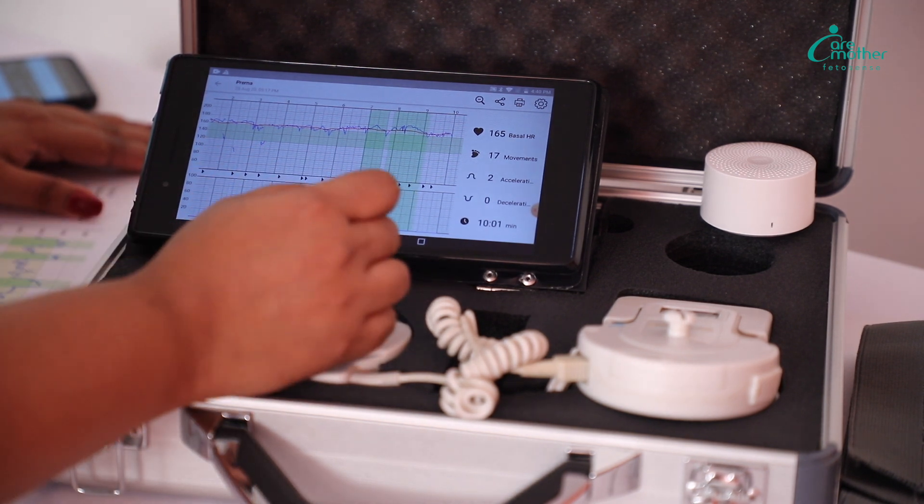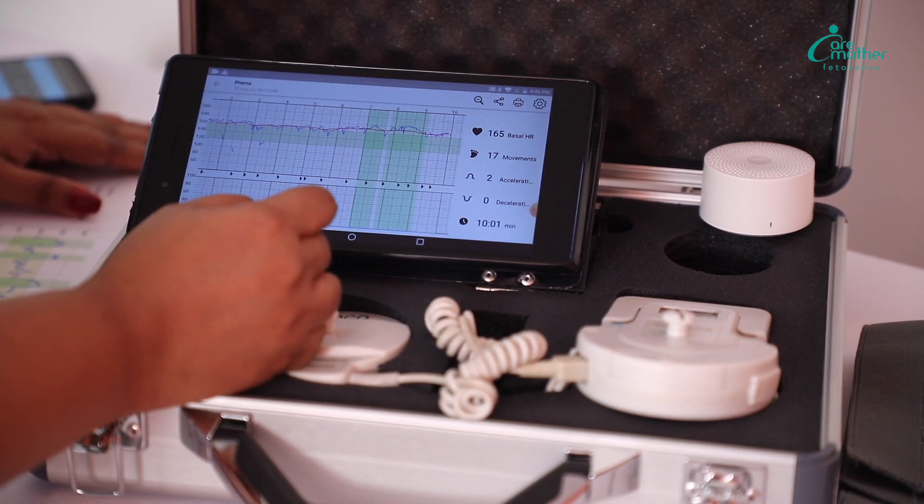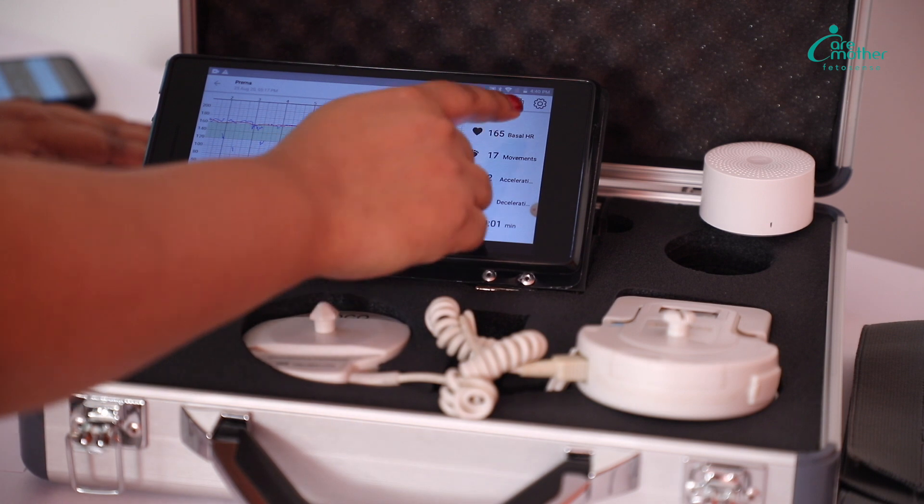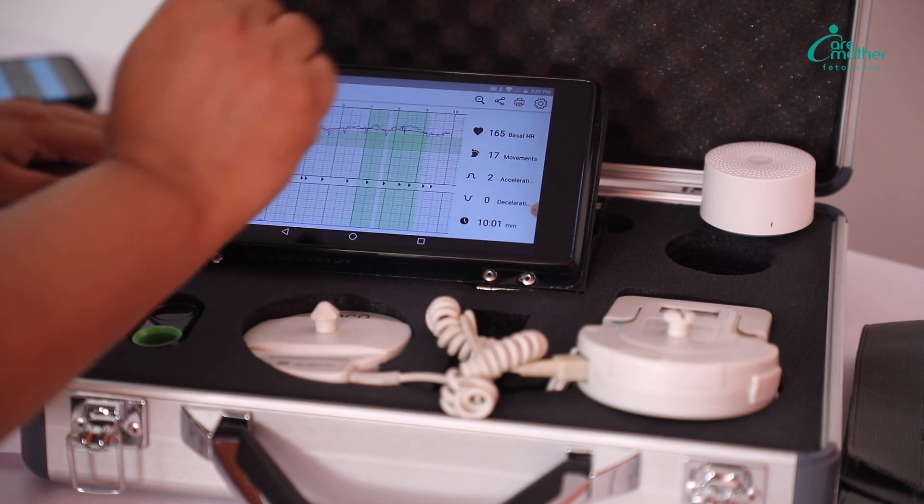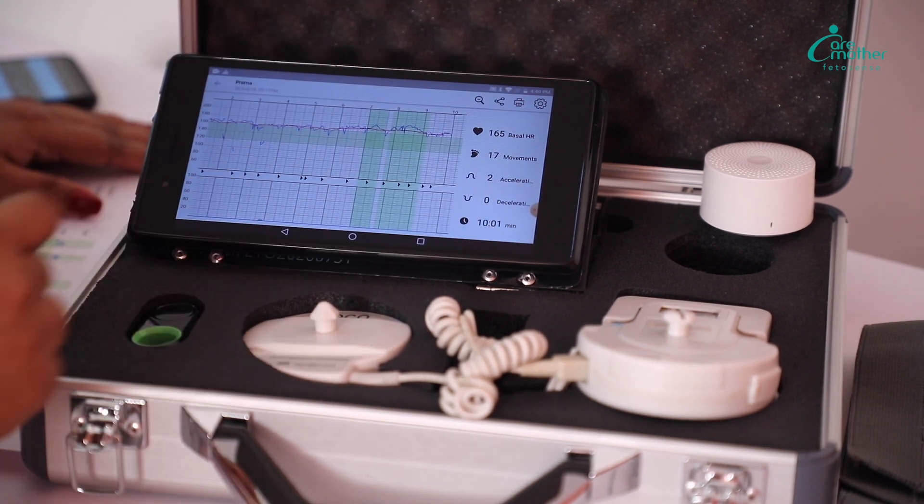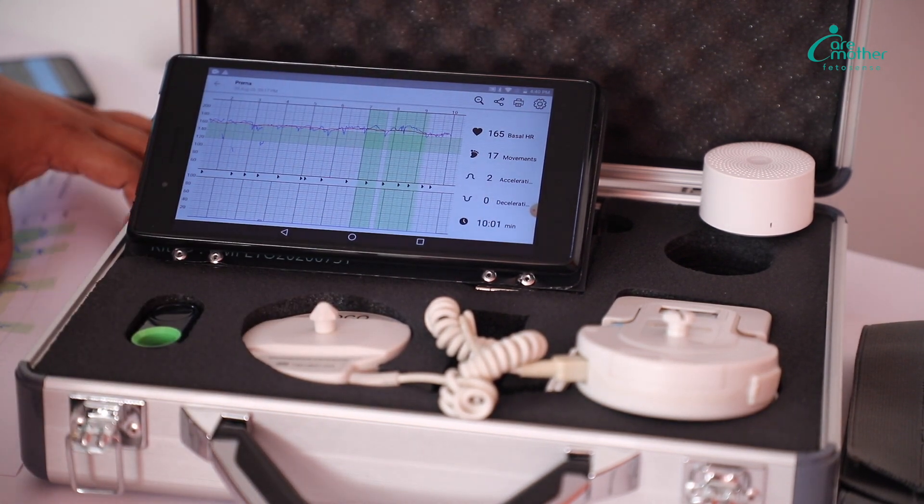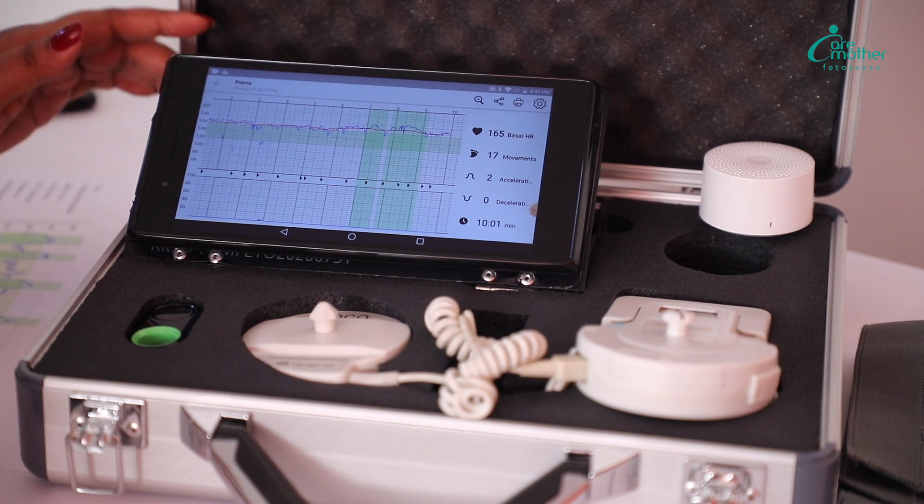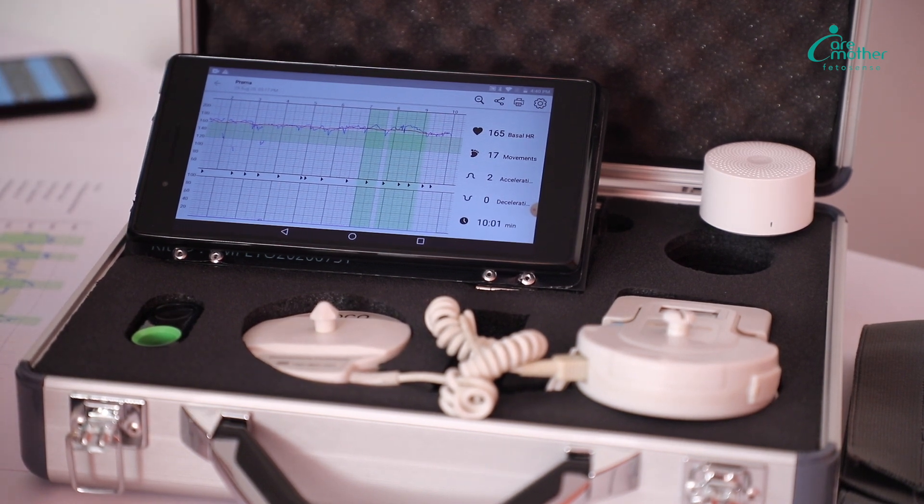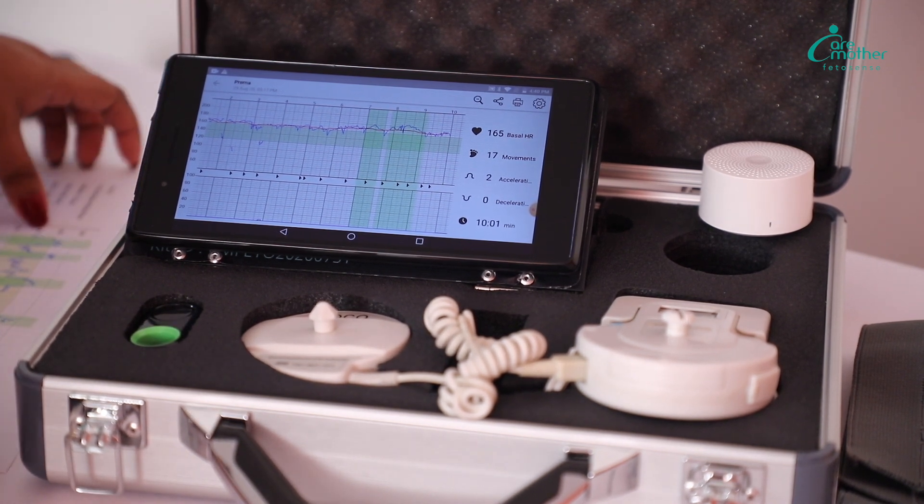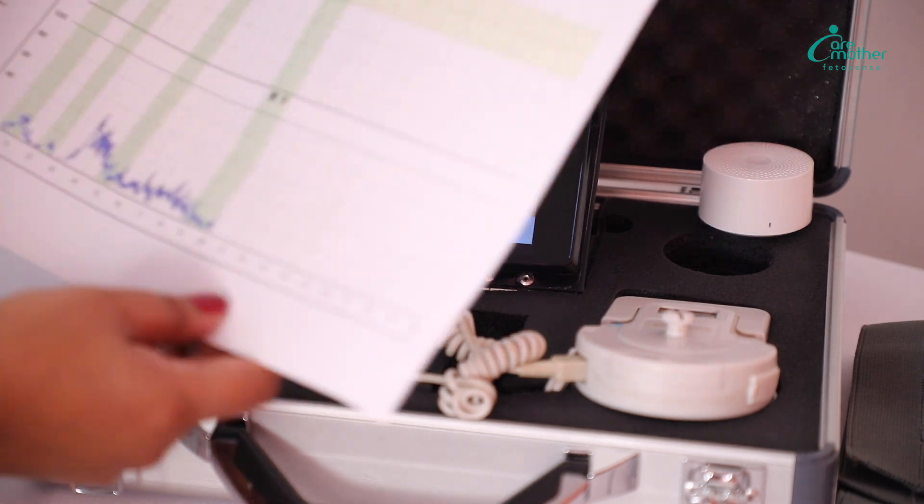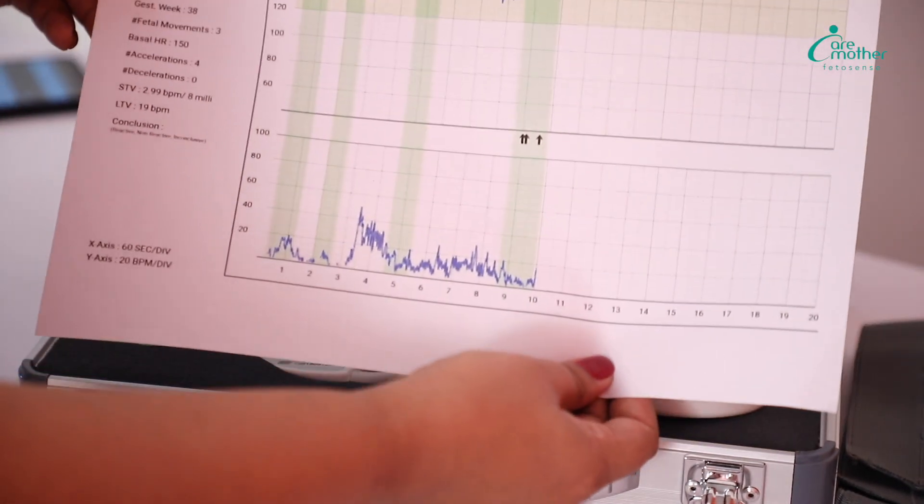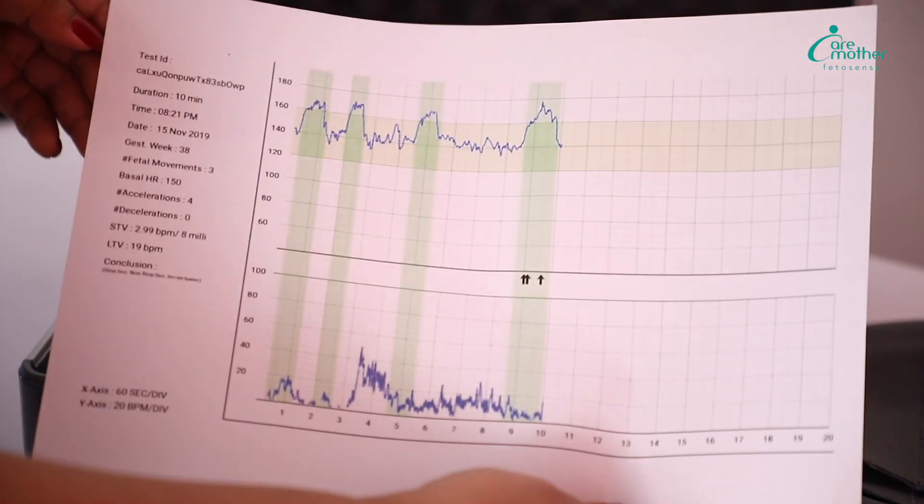You can go back to the test at any point in time at a later stage and print the test using this print tab. This device is capable of printing the test on a normal A4 paper. This is how the print report will look like.